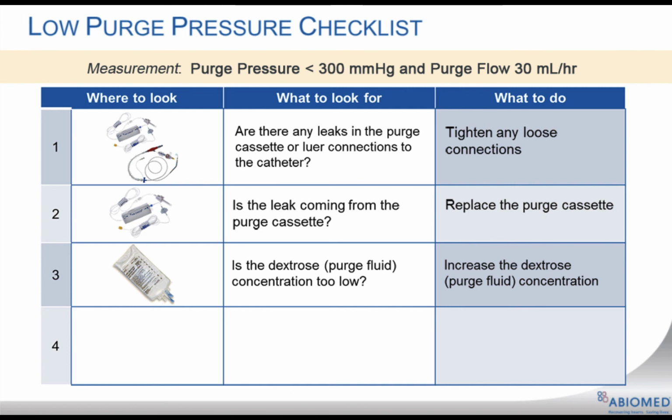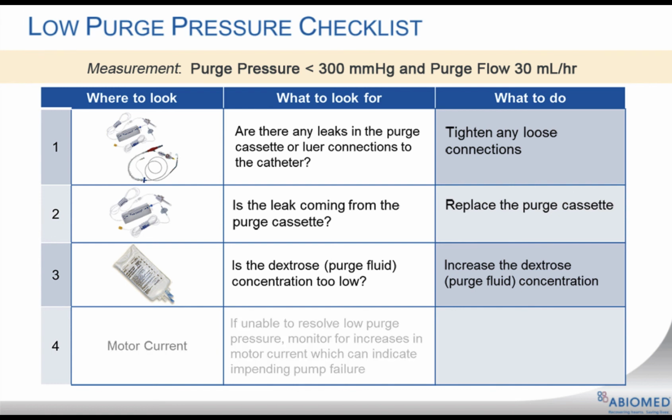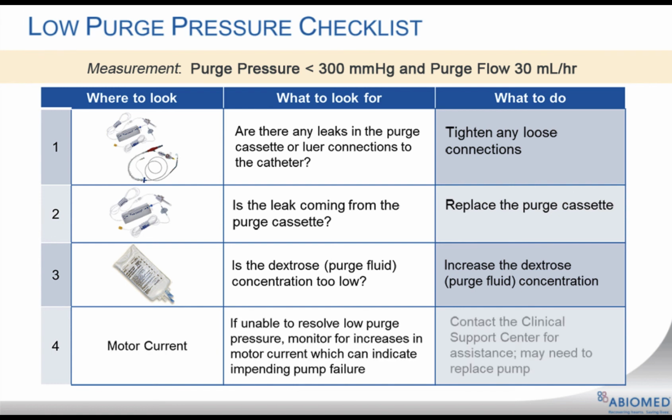If unable to resolve a low purge pressure alarm, monitor the motor current for increases, which can indicate impending pump failure.